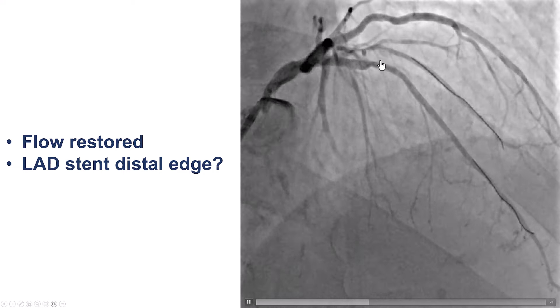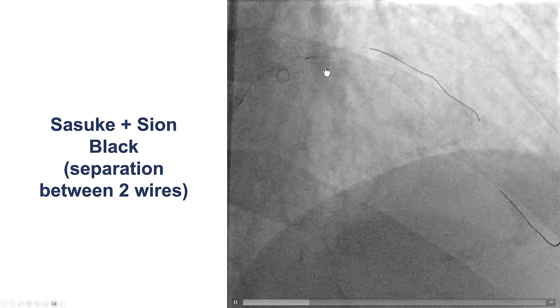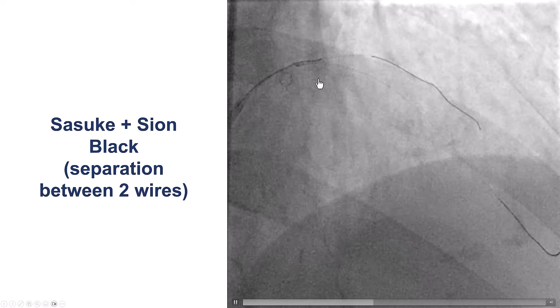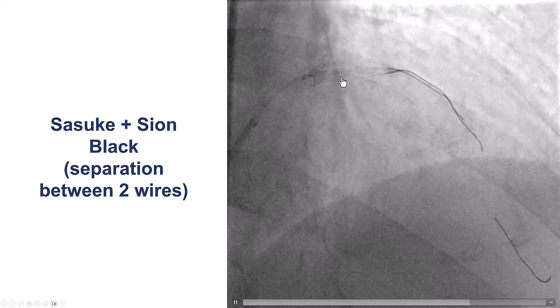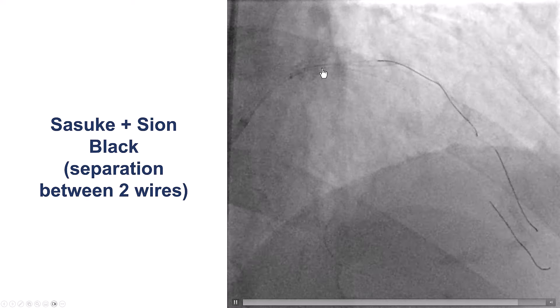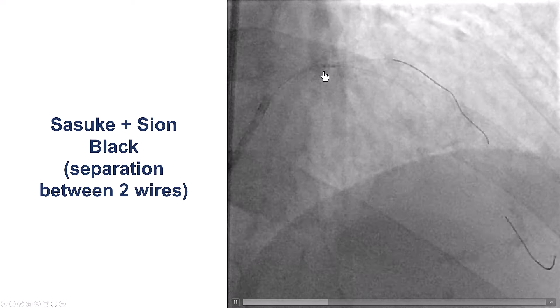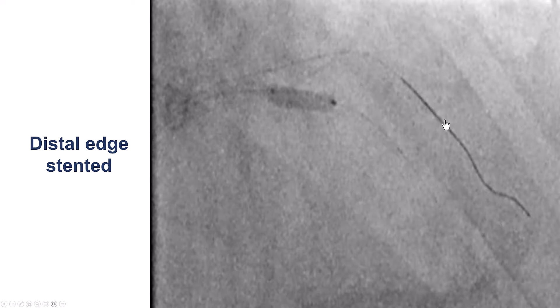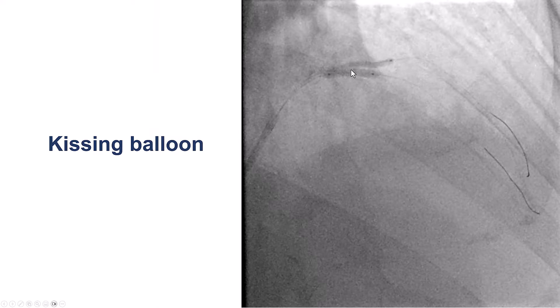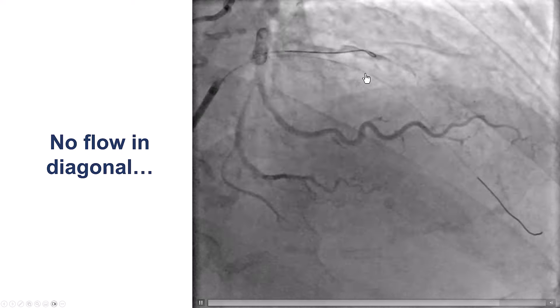Now we have better flow in the diagonal branch. We still have the issue in the LAD stent. We once again used the Sasuke to advance a guidewire into the side branch, and this time it was quite easy to advance a Sion Black wire into the diagonal branch. However, there is some distance between the second wire inserted and the first wire already in the diagonal branch — the significance of that will become apparent subsequently. There is some separation between the two wires. We stented the distal edge of the original stent, then did kissing balloon inflation. However, to our surprise, we had TIMI zero flow in the diagonal branch.